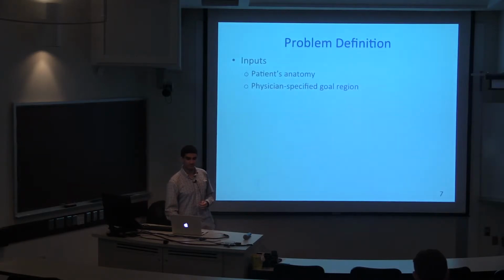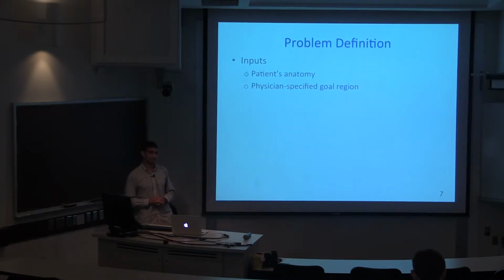And more formally, the inputs that we're given are the patient's anatomy, because the patient's anatomy matters, and a physician-specified goal region. The patient's anatomy can be obtained by a CT scan or MRI, and the physician-specified goal region could be represented as a set of cubes.